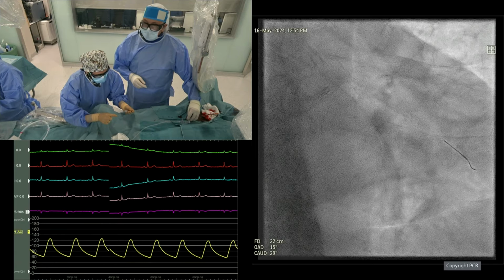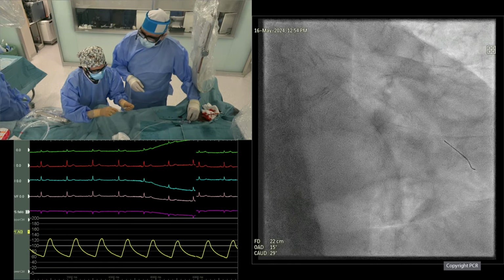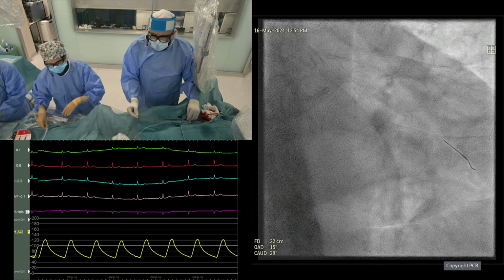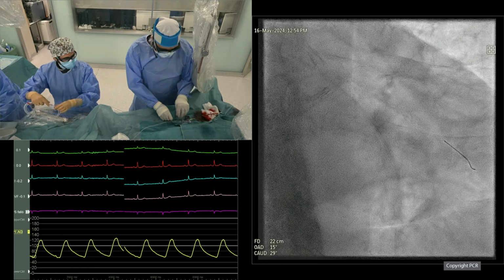In my opinion, and that's why I would have maybe done it a bit differently in my practice, with the backwards orbital atherectomy moves, I don't, because if it's differential cutting and about removal and debulking, which I think is the purpose of doing this, I would not be reluctant to do it on the forward way too, because at the end I want the least calcium possible.